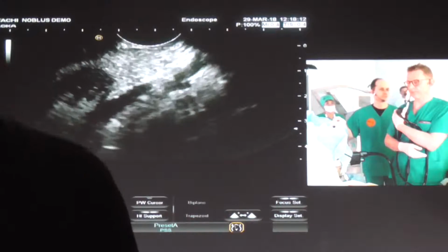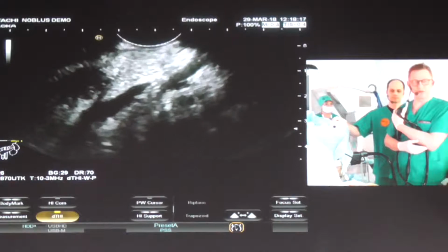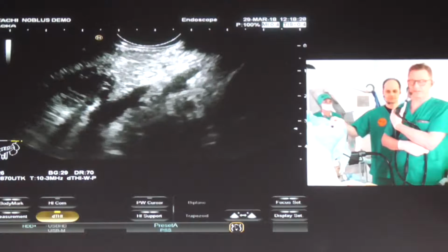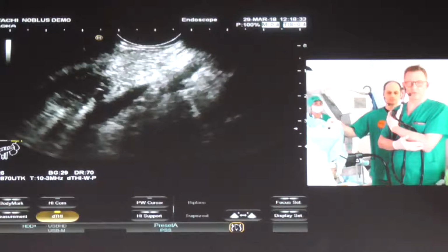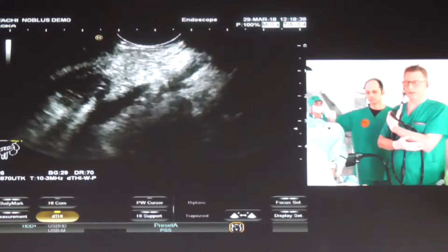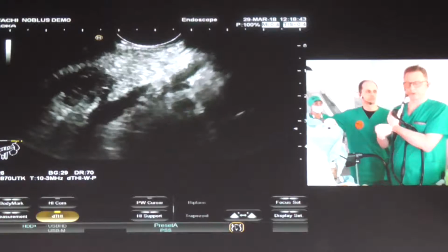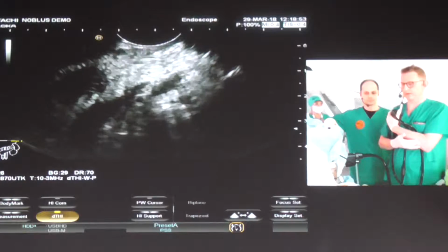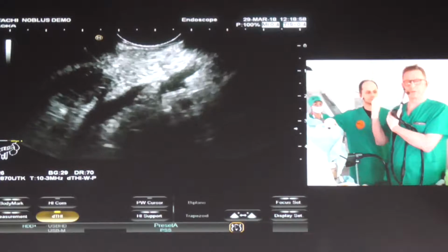As you know, I did my first EUS FNA in 1991, so it's about 26 years ago, and I think it has turned out to be a success. Mediglobe was the company that was foreseeing at that time, and Mediglobe was also the first on the market with EUS needles. We designed the needles together with Mediglobe, and any other needles on the market are made based on this principle, like the first needle we initially did, with a detachable handle and with a piston that can move a needle in and out.